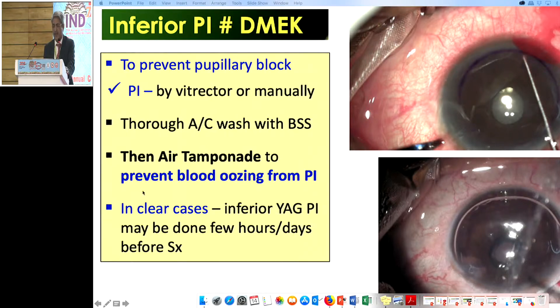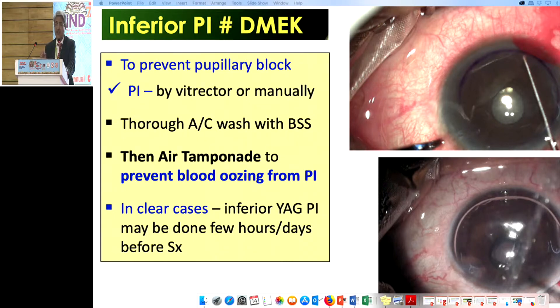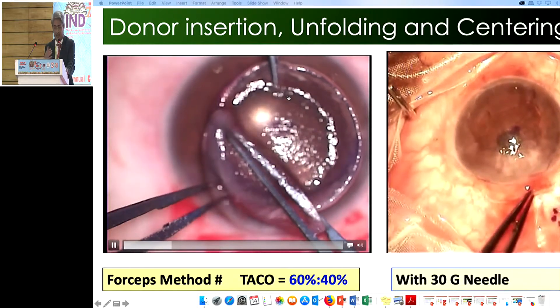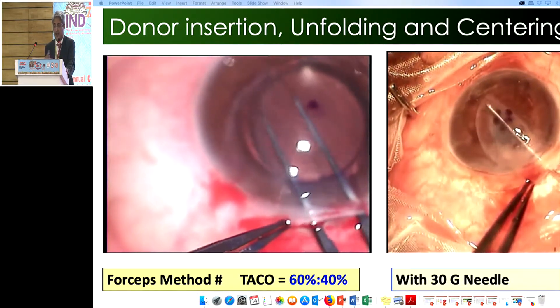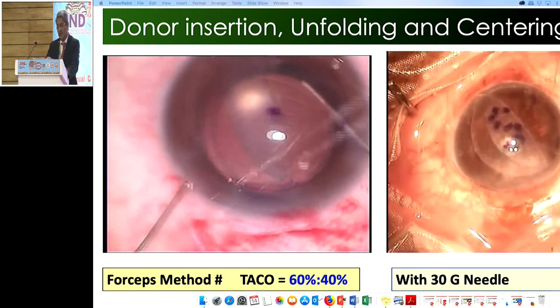Remember that there is bleeding whenever you perform PI, so apply immediate air tamponade for three to four minutes to stop the bleeding, otherwise the blood can ruin the surgery. You must remove each bit of fibrin thread from the anterior chamber. In clear-cornea cases in the western world, inferior YAG PI can be done three to four hours before surgery or one day before. For donor insertion and unfolding, there are different techniques; I prefer the taco technique and sometimes the needle technique with or without sheet glides.